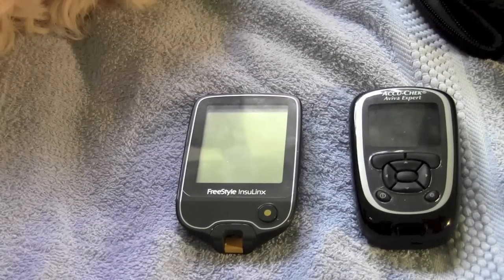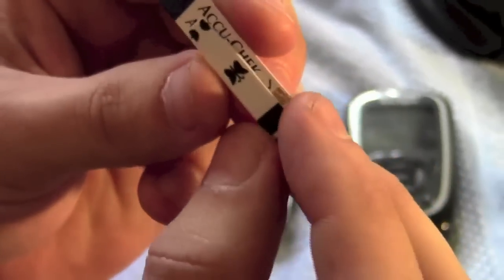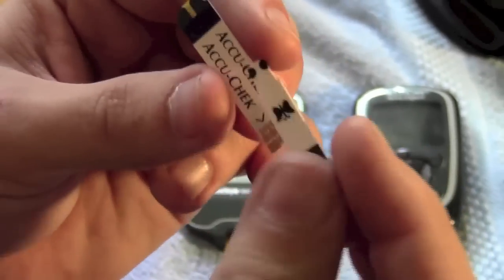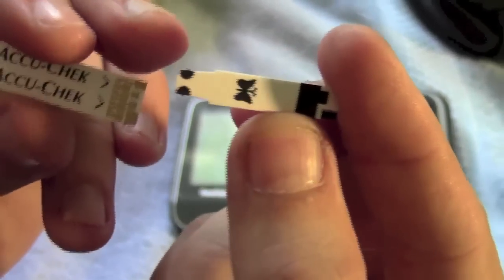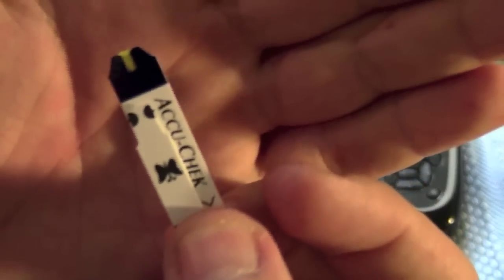The first thing we'll take a quick look at is the test strips. There's the AccuCheck Aviva one, and there's the Insulinx one. As you'll notice, the Insulinx test strip — which is also used with the other Freestyle meters and known as the Freestyle Light test strips — is a fair bit smaller than the AccuCheck one.